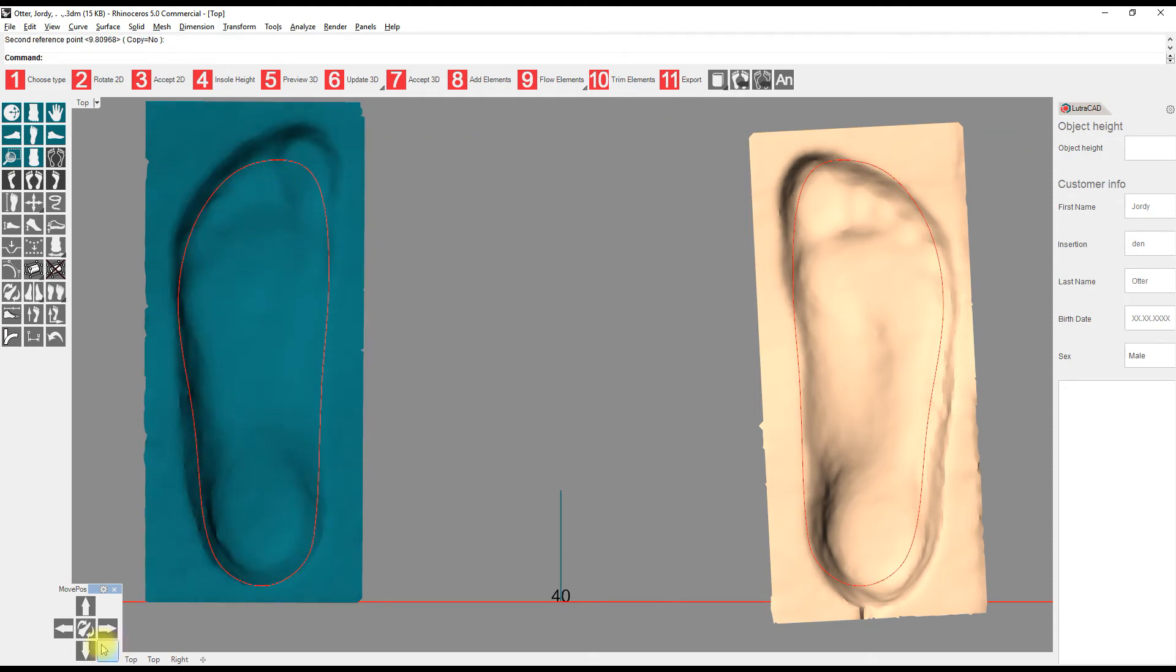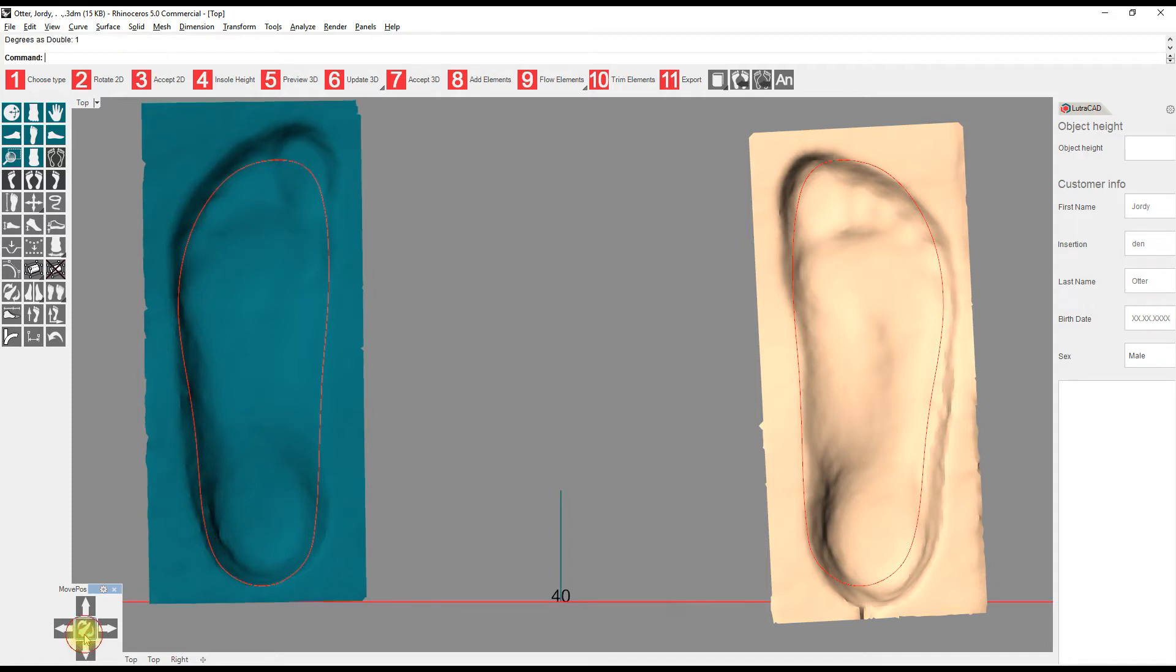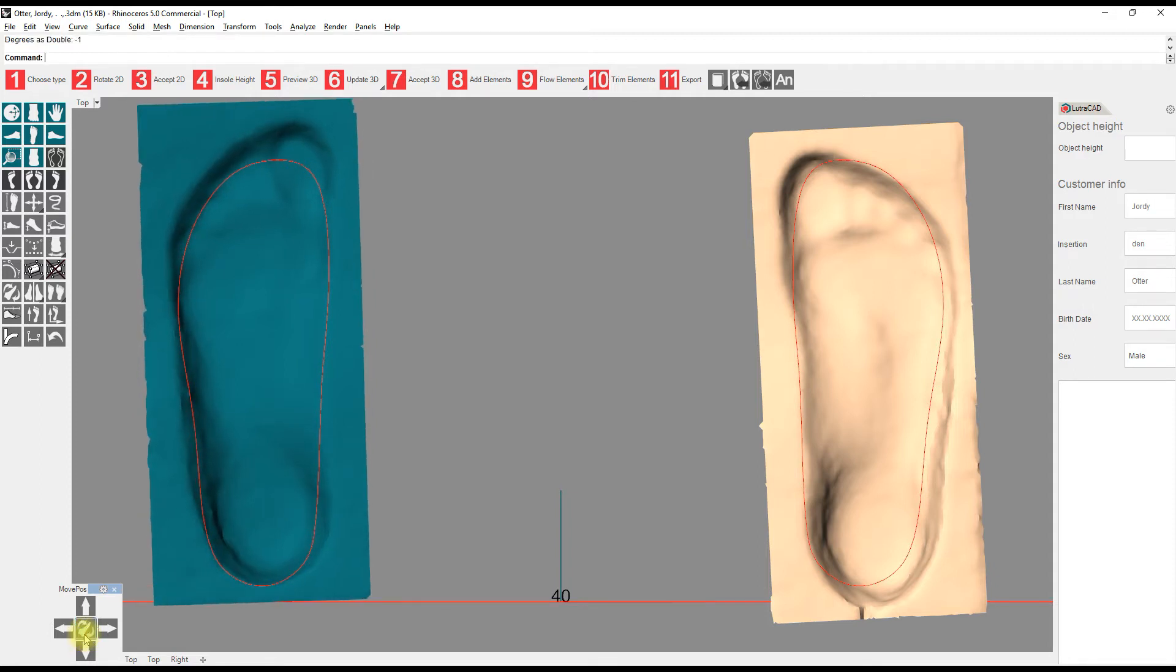The second option is using the middle button on the bottom left toolbar. With the left mouse button, the scan will rotate counter-clockwise, and with the right mouse button, it will move clockwise.